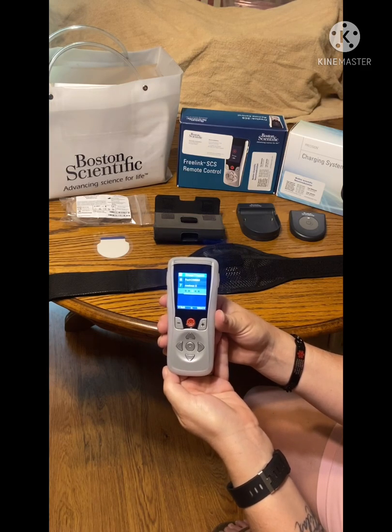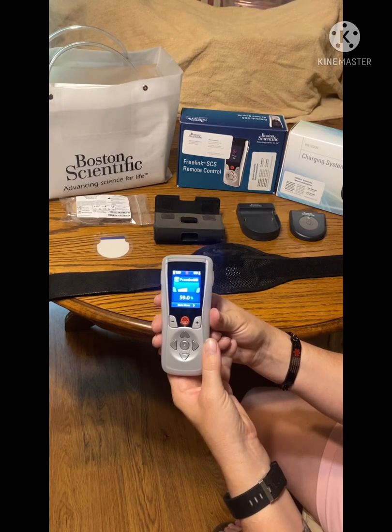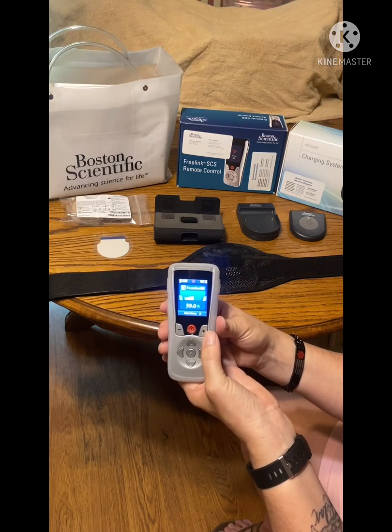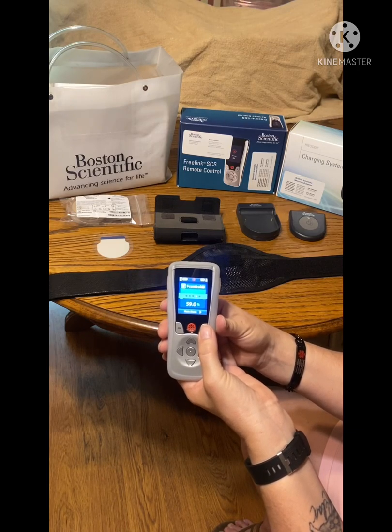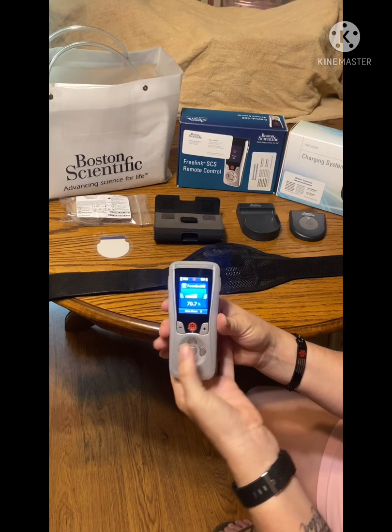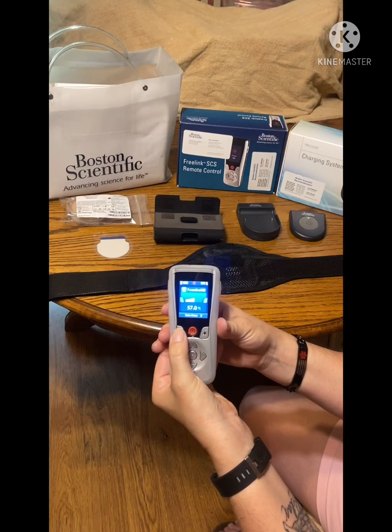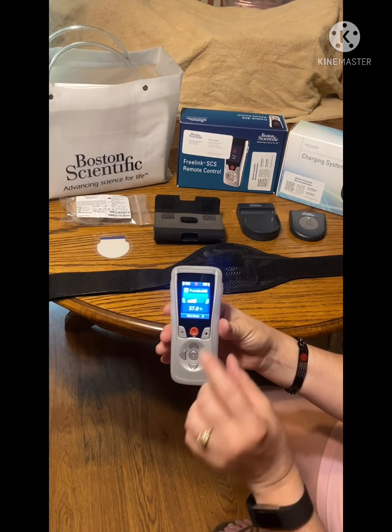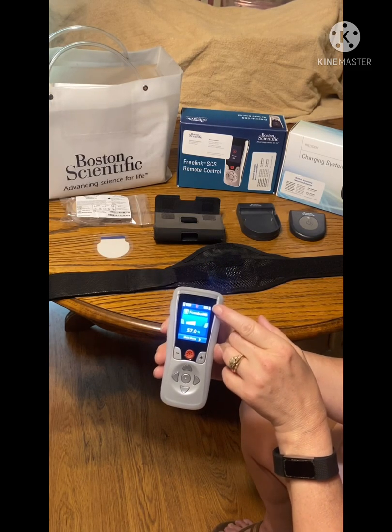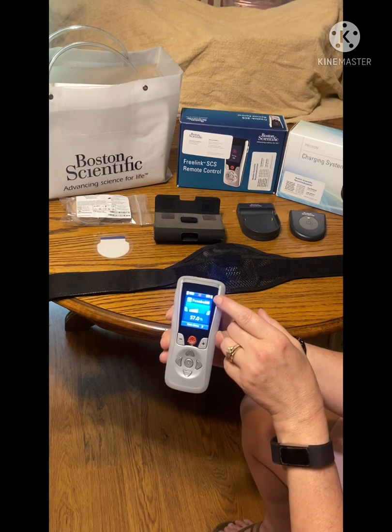Waiting for it to think. Sometimes you have to have it closer to where your generator is. It's saying that it's good. If you want to turn it up, you just push this plus button, wait for it to think, turn it up or turn it down. Right now my normal is set at 57%.